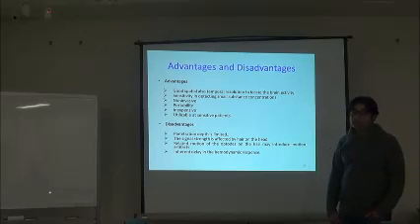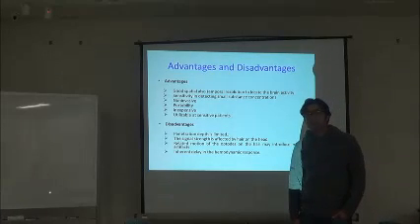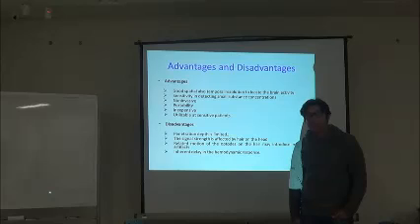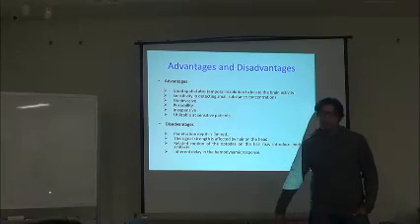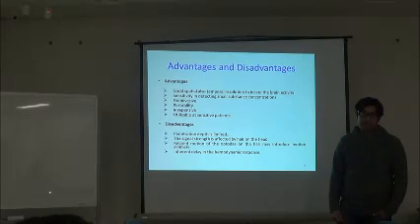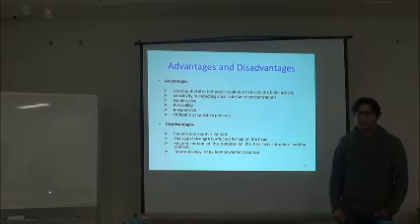If we add more wavelengths in the fNIRS systems, and we can know the absorption rate of proteins, can we measure the protein absorption? Yes, but actually, I don't think that there are proteins inside the blood. But we can remove the artifacts due to the hairs or some external things. Yes, that is possible.